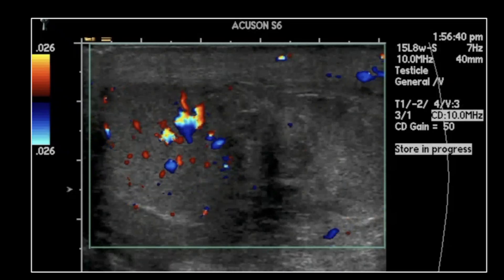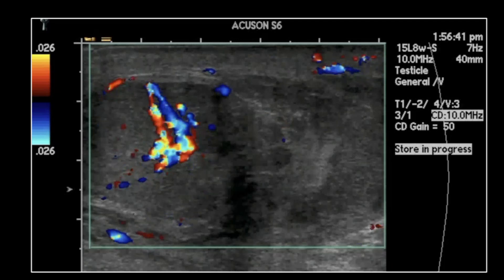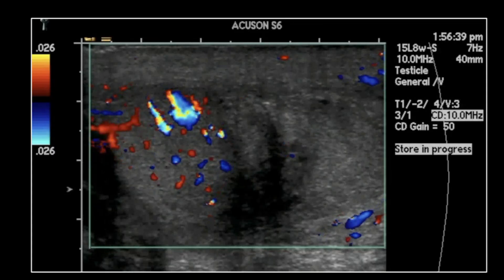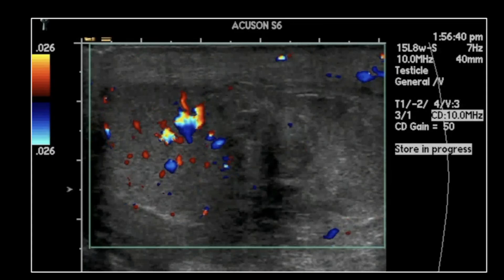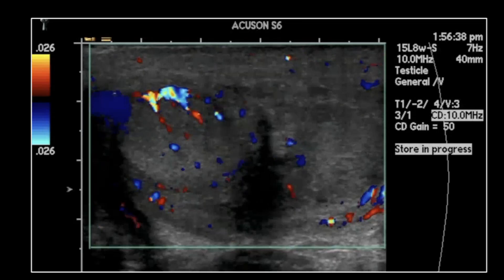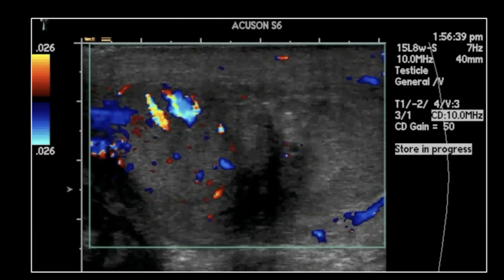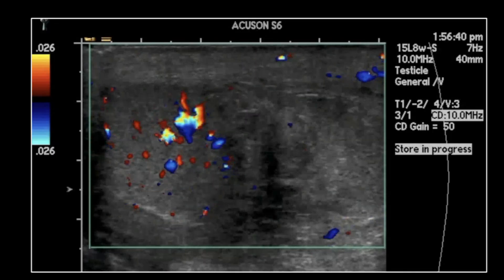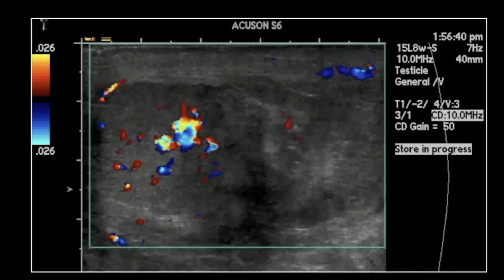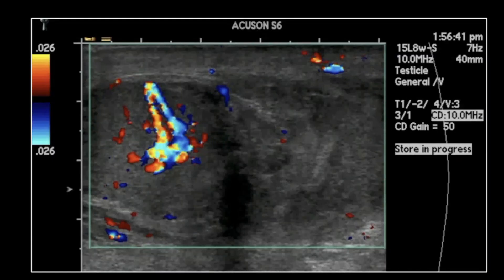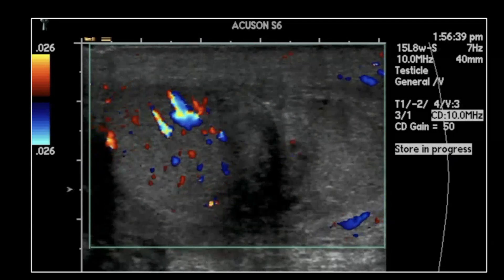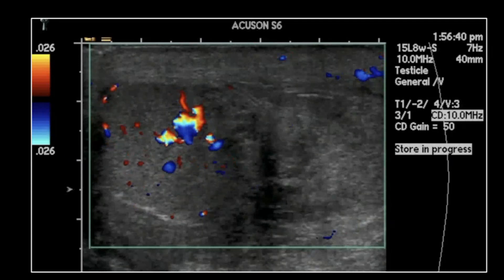You don't see flow in that left testicle. What else don't you see in that left scrotum? There's not a very clear testicular margin. You really don't see a testicle proper — no homogeneous testicular parenchyma with a clear circumferential definition. This is a testicular rupture. All that heterogeneity on the left side is just hemorrhage, and the little dots of flow you're seeing are probably active bleeding.